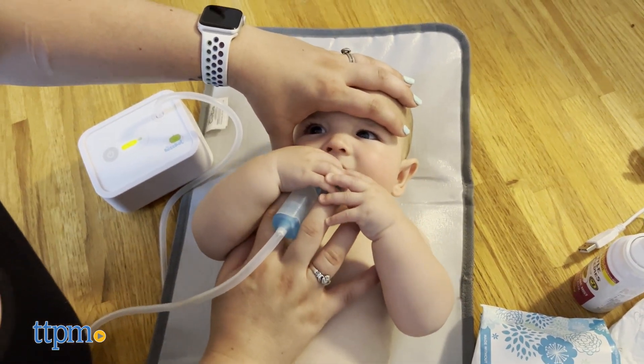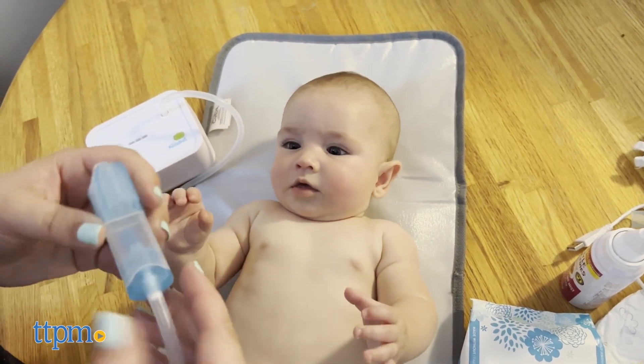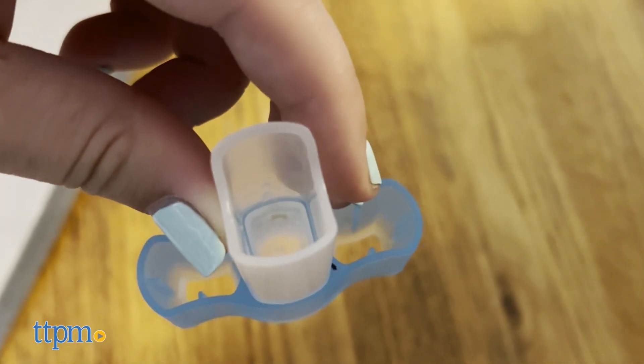Each level got louder, which continued to scare Riley. However, the first level did have enough suction to get some of the big boogers out, which was pretty helpful.